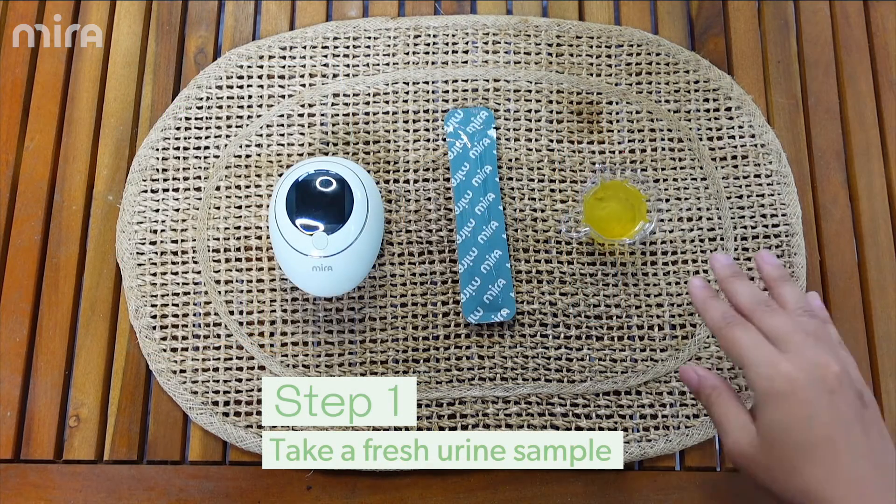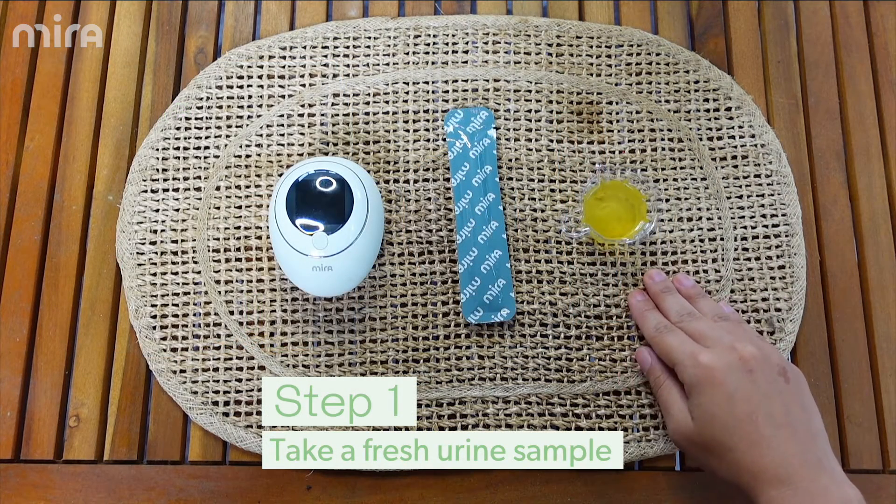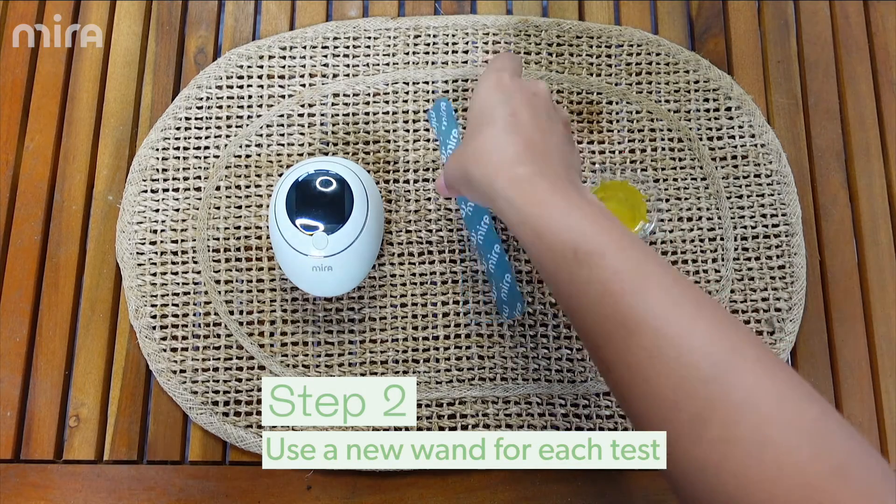Step one, you're going to use a fresh urine sample immediately after collecting it. Step two, use a fresh wand for every test.